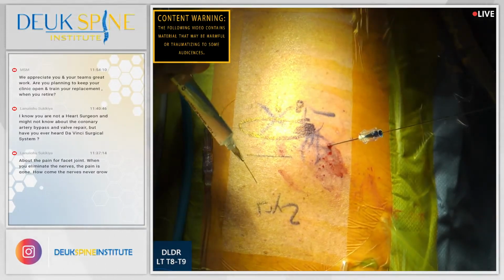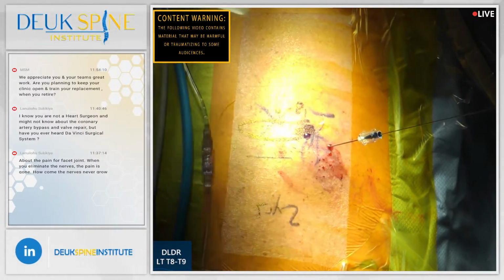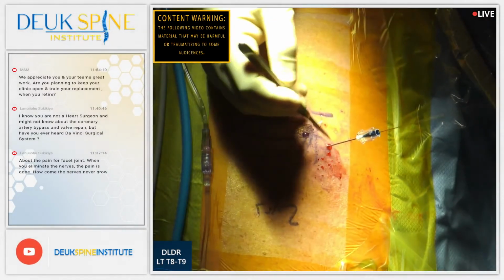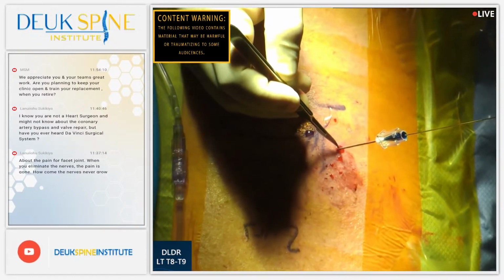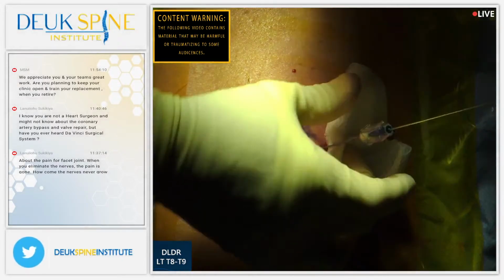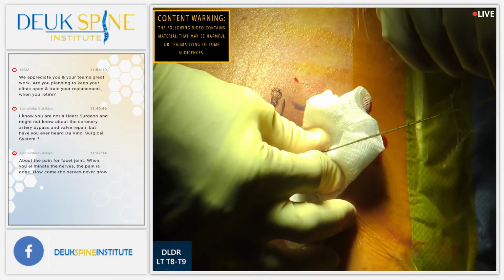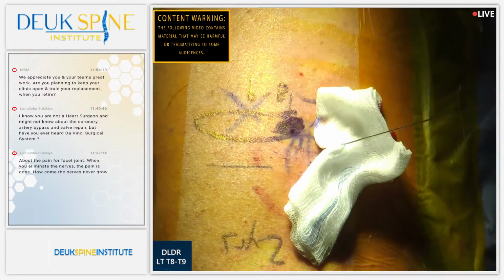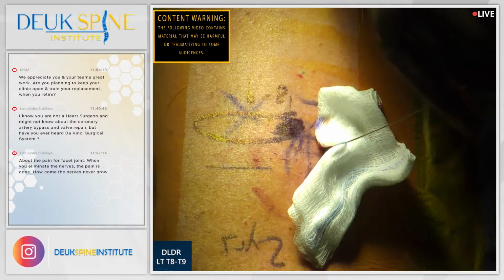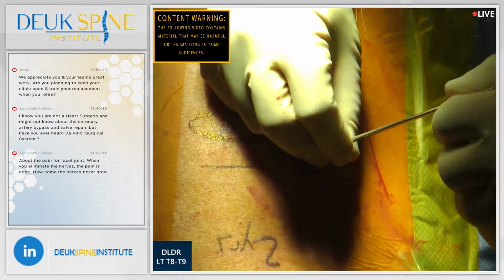Okay, welcome back. We just tested the disc to see if it was painful, and it sure was, but he couldn't give us a number. So we'll call it concordant, and we just won't give it a number. We're going to proceed with our endoscopic procedure. Yeah, no, I woke him up. And right now we're making a 4mm incision, taking out the needle that we use to access the disc transforaminal and the herniation, and we're going to place a dilator over the guide wire to create a small path for our tube. The surgery is relatively bloodless.